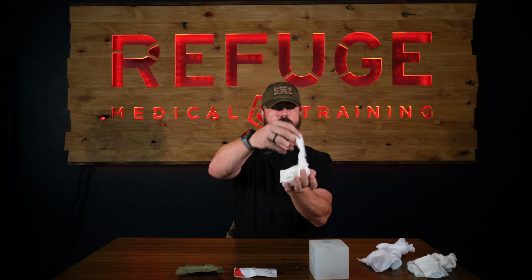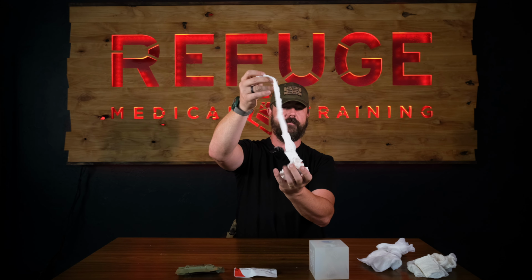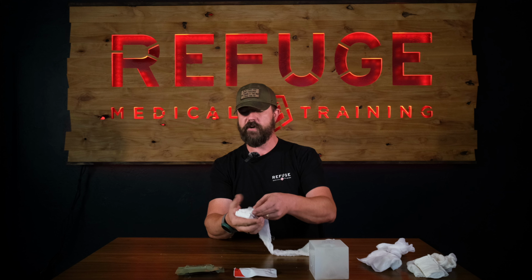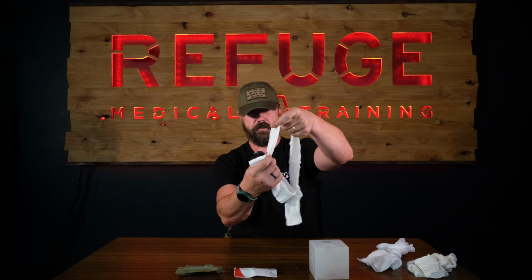So we're dealing with the same thickness here in these two. Same philosophy, flex it, fluff it a little bit, find the edge, right here. But it has a Z-fold to it. It just goes back and forth, okay? So I can hold this in my hand while I'm packing that wound and just pull, and it just unfolds, almost like a magic deck of cards, if you ever had one of those when you were a kid. And again, very thick and dense, so you can see how thick that is.